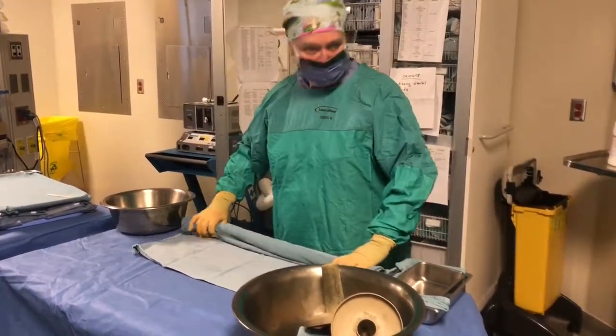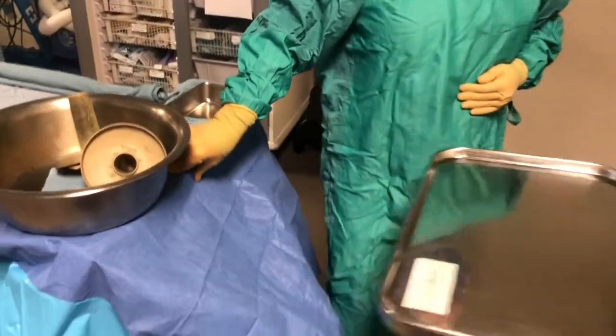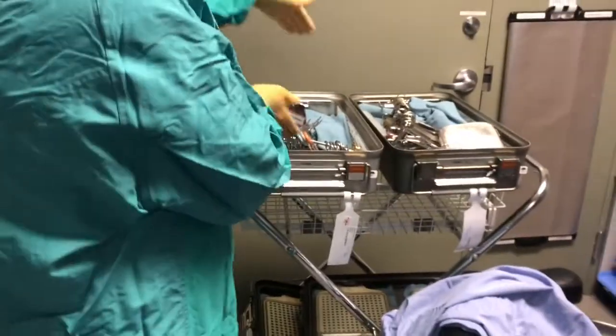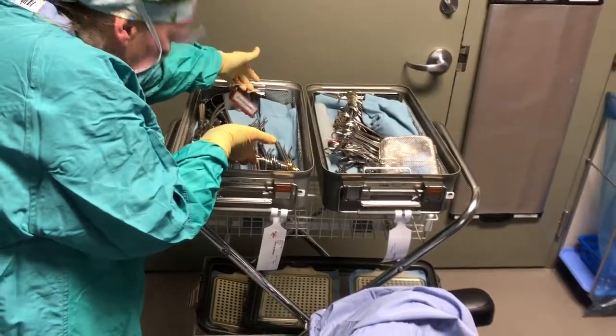Right. All right. So, now of course I don't want to touch any of this stuff, so I'm going to move it with my foot, and you do a lot of things with your feet. You're a scrub nurse. Right? Okay, so I'm going to take this. I see that there's an indicator, so I'm going to pick this up. I'm going to see that I'm pretty far away. I'm not touching anything. I'm going to bring it over.